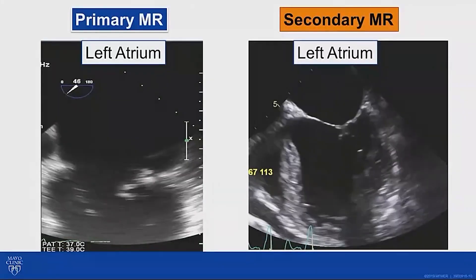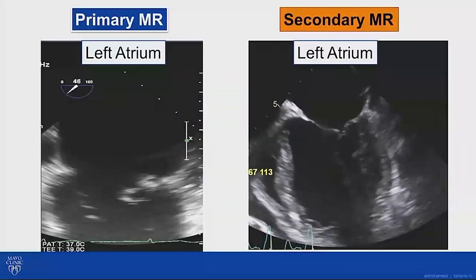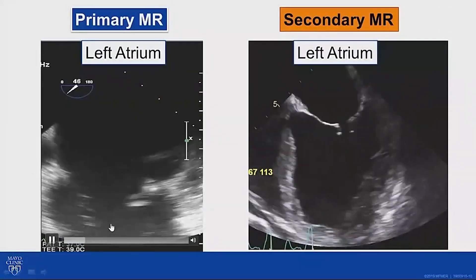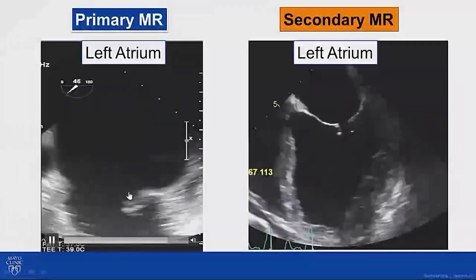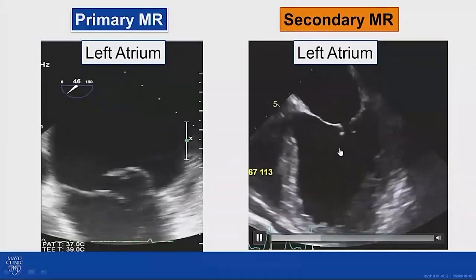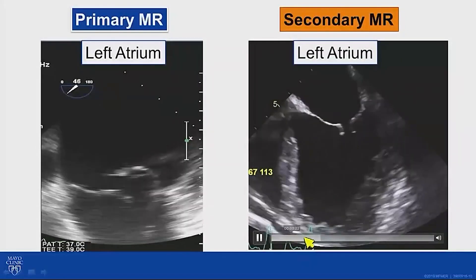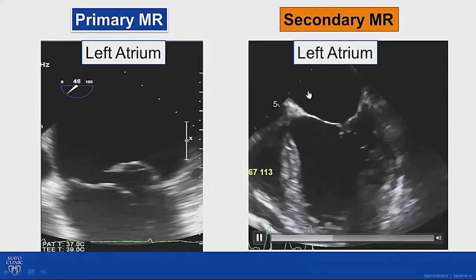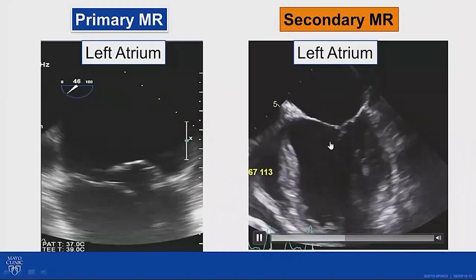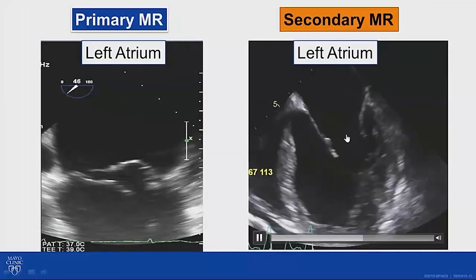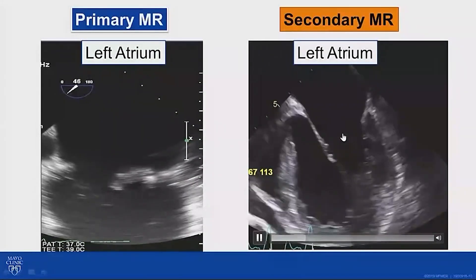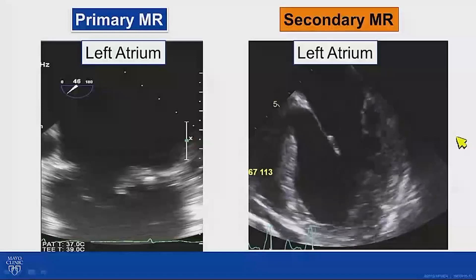A nice example: on the left side, similar to the last case of primary MR on TEE — left atrium at the top, ventricle at the bottom — we can see a flail P2 segment. On the right side, secondary mitral regurgitation: we've zoomed out, the mitral valve is in the middle, the ventricle is not contracting normally, the leaflets are apically displaced and tethered by the chordal apparatus, unable to coapt well, resulting in severe regurgitation.